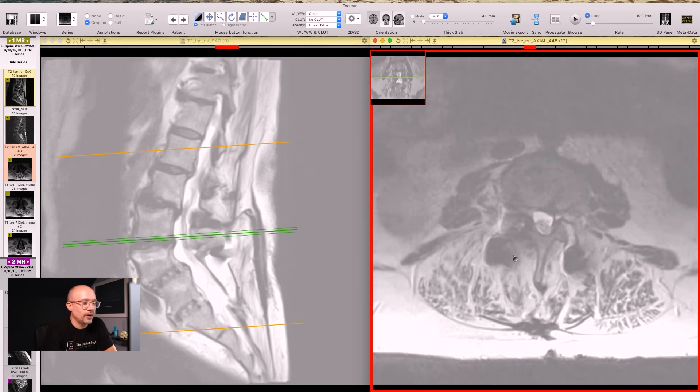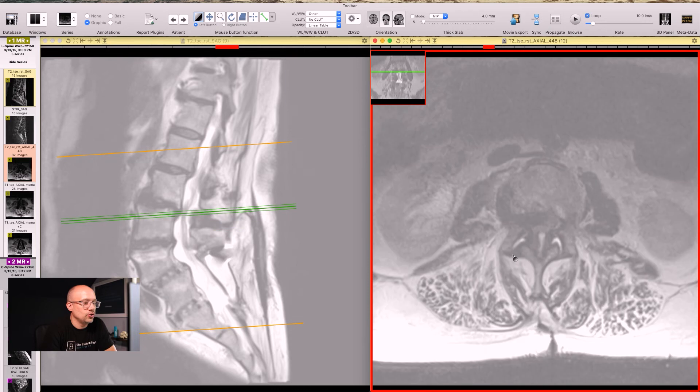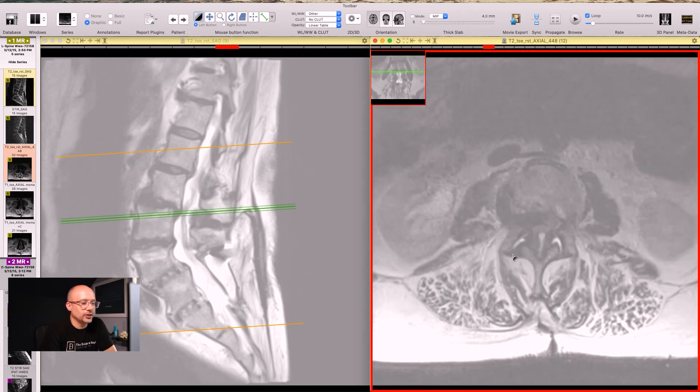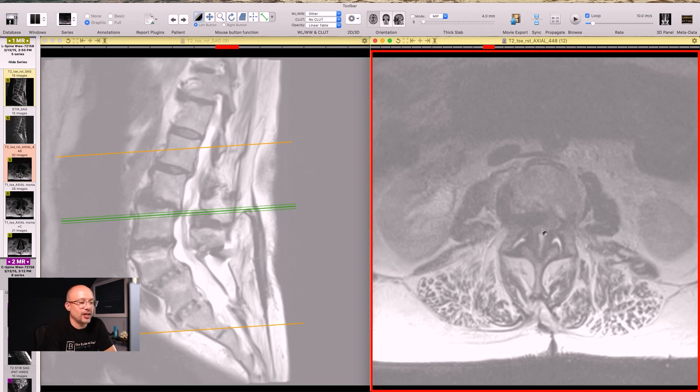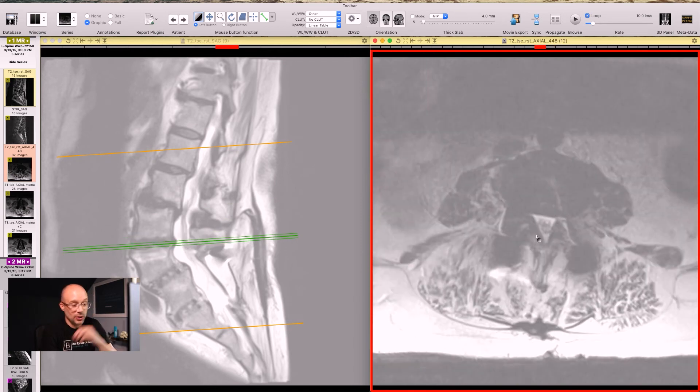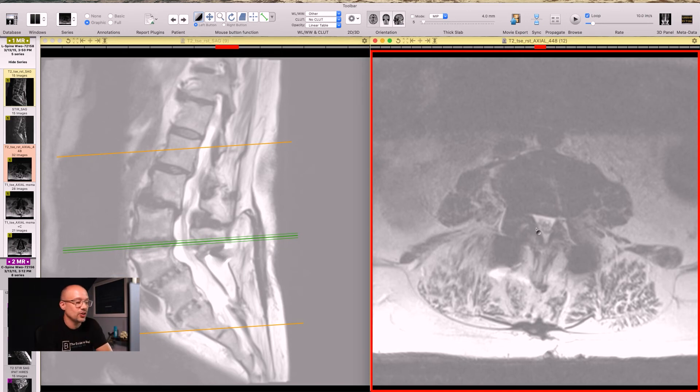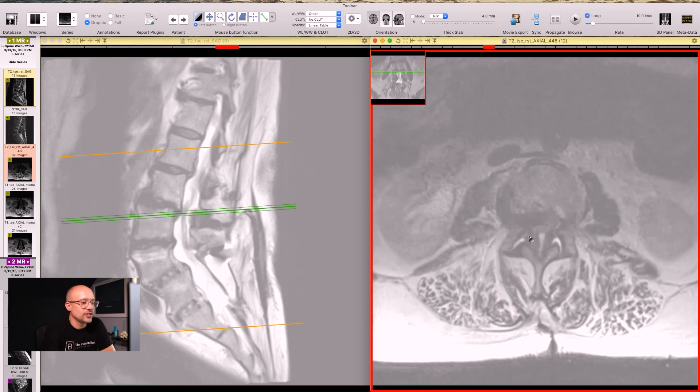Let's keep on going up as we go up towards L2, L3 oval. We see severely stenotic. Look at that little tiny area that I'm highlighting that is left of the spinal canal or spinal cord. Even compared to the level below, level below, that looks a lot bigger and healthier. To me, we could measure it, but I can just see it visually. That is much more healthy. It's probably moderately stenotic at L3, L4, but there is severe spinal cord stenosis at L2, L3.